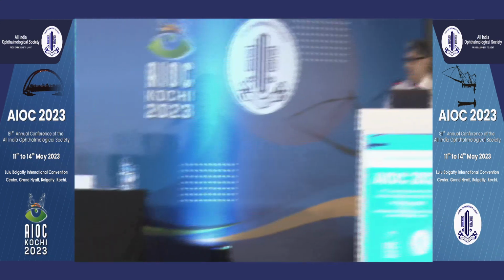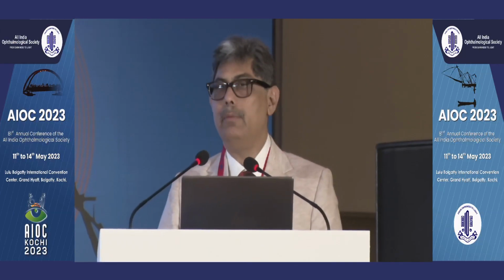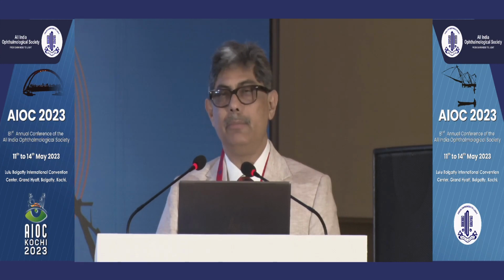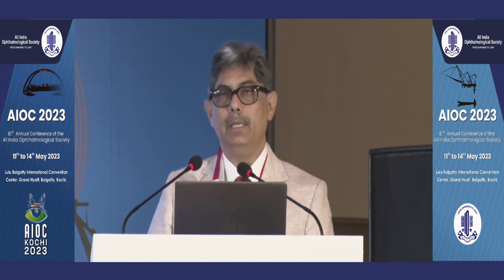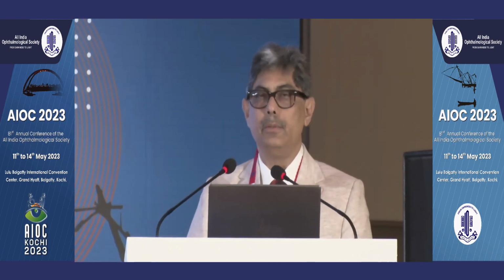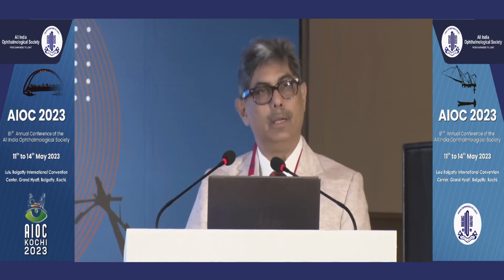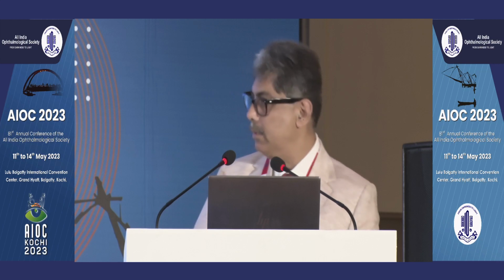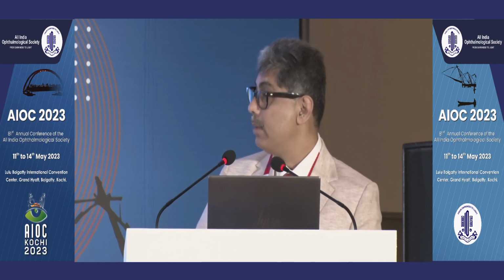Yeah, definitely. Sir, the company says that it is 2.8 millimeter, but in a personal way, I have done it in 2.7 millimeter also, and really the development of cataract and the vault is not an issue. Even with 2.7 millimeter, we can go ahead and do the phakic lens, in my personal experience. I would slightly differ on this.